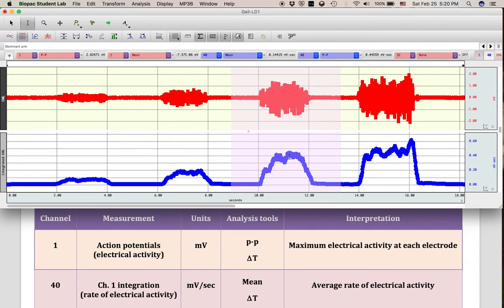And you would never want to take a peak-to-peak of your integrated channel because that doesn't really tell you a whole lot. What that's going to tell you is what your highest rate of electrical activity is and your lowest rate of electrical activity.